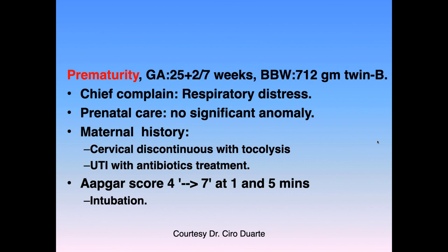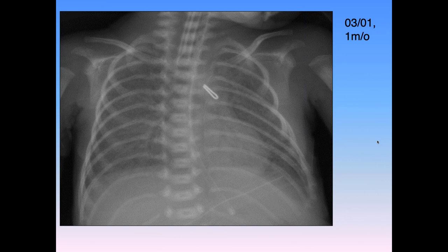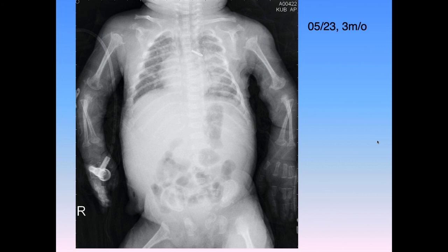Okay. Jennifer, what do you think of this case? So there's a clip overlying the superior mediastinum. So I would be thinking this is a PDA closure device. And sometimes they give indomethacin as well.